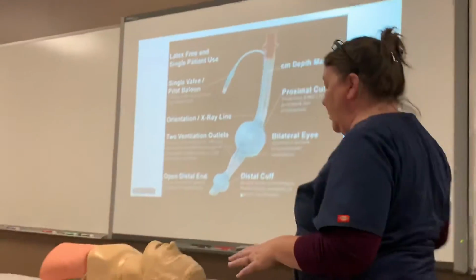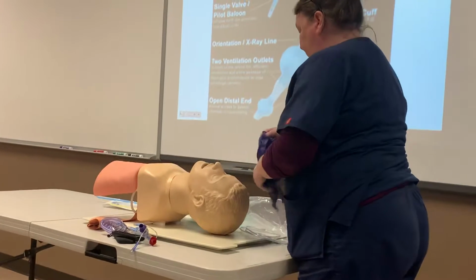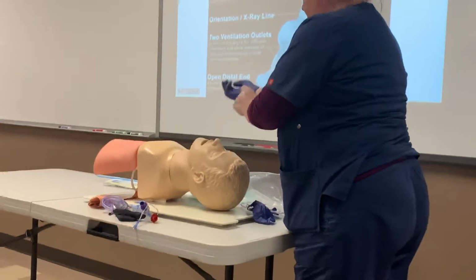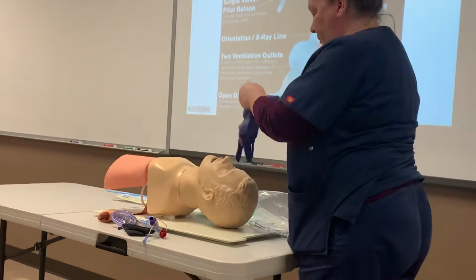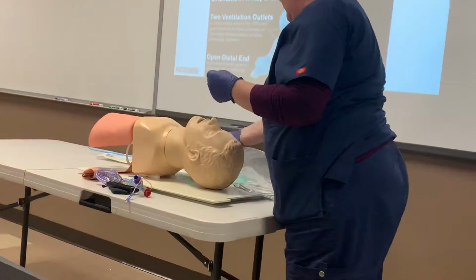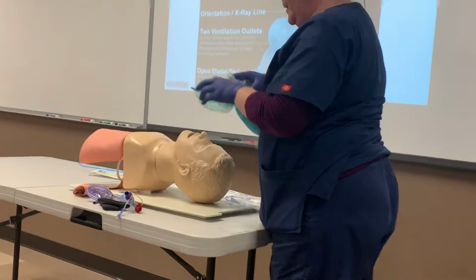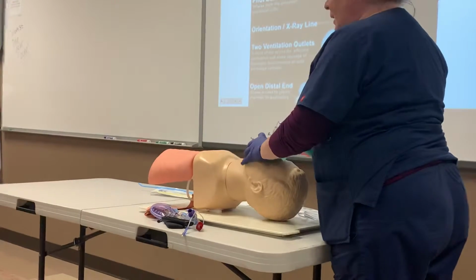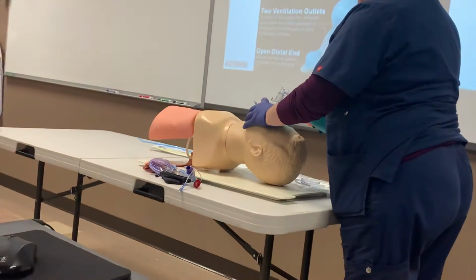So let's talk about, I've got my patient here and I'm going to intubate them. So what's the first thing? Let's say we got all our supplies and everything. What are we going to be doing? Looking at the airway. The patient's not breathing, it needs to be intubated. What do we need to be doing? Bagging them. Manually ventilating. So the first thing you have to wonder is, can I do this effectively right now?